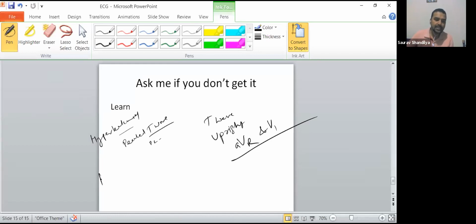Now, hyperacute T waves. It happens. The T wave goes like this also. In that case, we say hyperacute T waves. What does a hyperacute T wave say? Early STEMI. Now don't ask me about STEMI because every one of you knows it is ST elevation myocardial infarction. Hyperacute T waves occur in that.